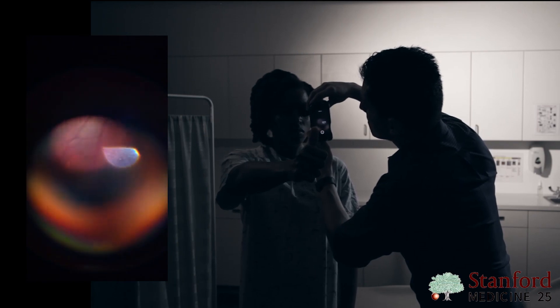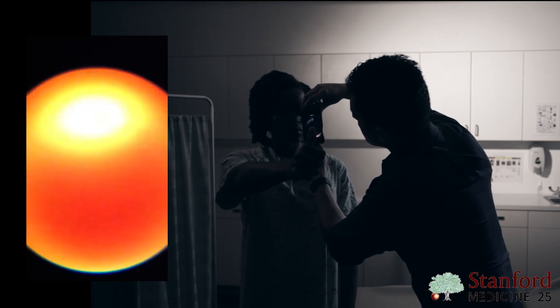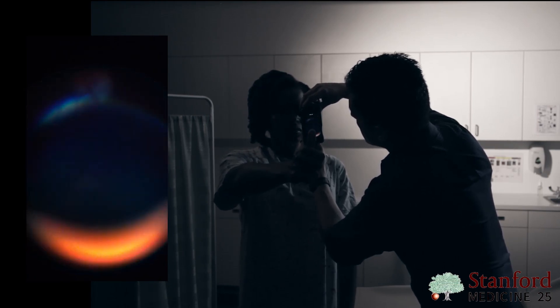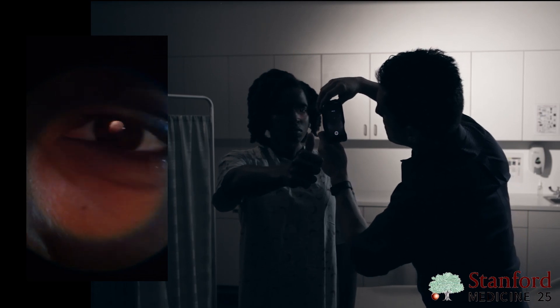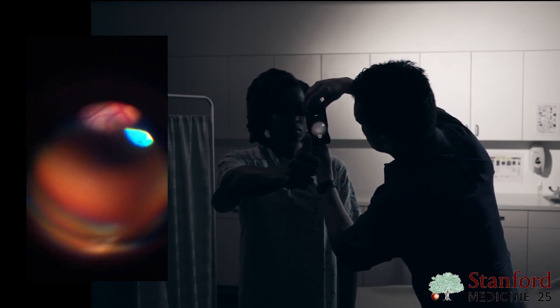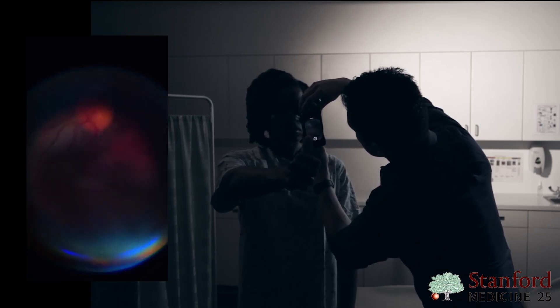You get closer and closer and you can see the optic disc and a little bit of the bright optic cup within the optic disc. The patient may blink, which is very common, and sometimes they get uncomfortable and you lose the view — no problem, just come back in and visualize the optic disc again. The optic disc is the best place to visualize because it can be associated with a lot of medical pathology, and there are no rods or cones there, so it causes the least amount of pain and least pupil constriction.